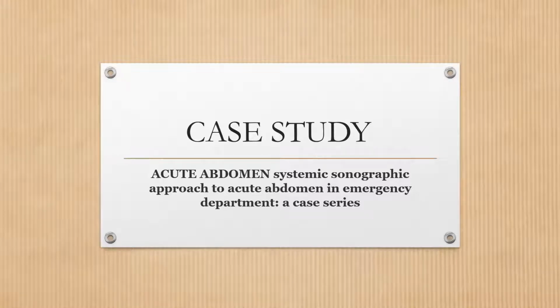Good morning. Our topic for today is acute abdomen: a systematic sonographic approach to acute abdomen in the emergency department.